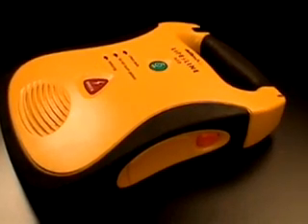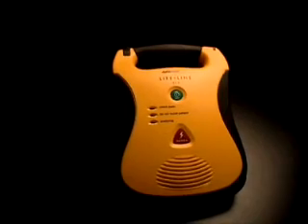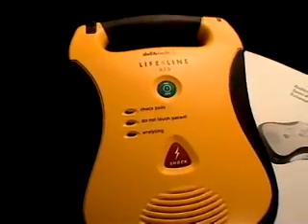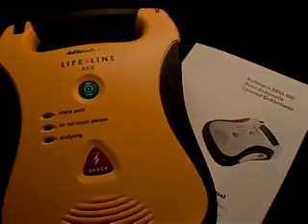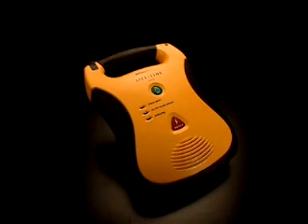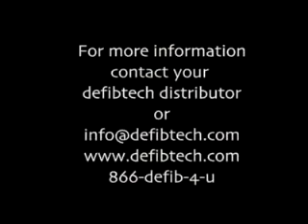The Lifeline AED should be kept with the battery pack inserted and the pads connected and stored in the pad holder. The unit should be kept in a readily accessible location with the active status indicator visible. This video presents only a quick overview of the Lifeline AED — refer to the user's manual for more detailed information and get comprehensive AED training before attempting to use the device. With sophisticated medical technology this simple to use, now anyone can save a life.